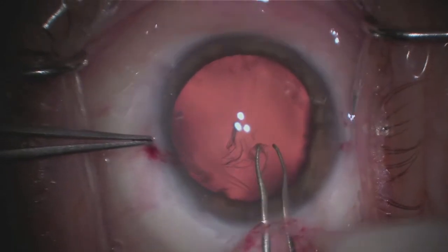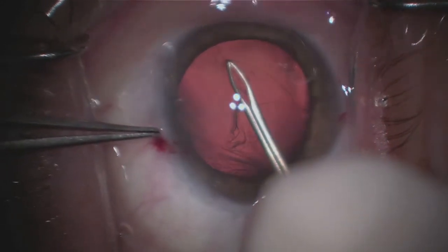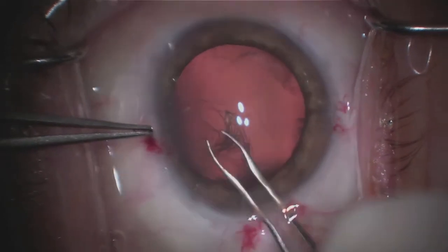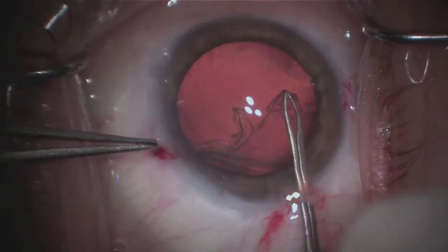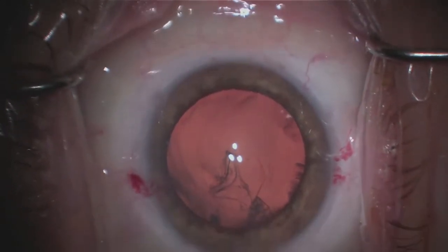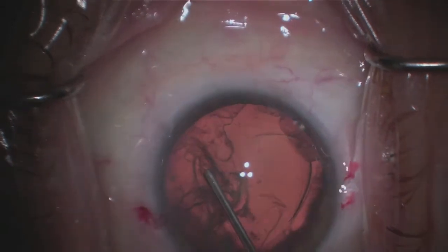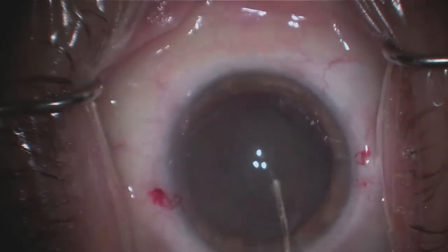In this next step, I'm tearing the anterior capsule in a circular fashion, creating an opening to the cataract. As you'll see, I'm turning around in circles here, creating a nearly perfect circle. Now that that membrane is out, we have direct access to the cataract. If you envision removing the inside contents of a grape but keeping the skin itself intact — except for that round opening we made.